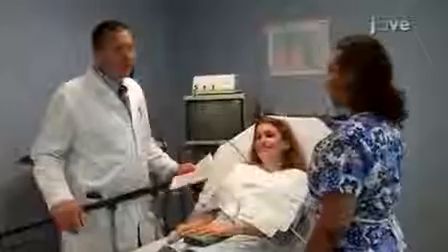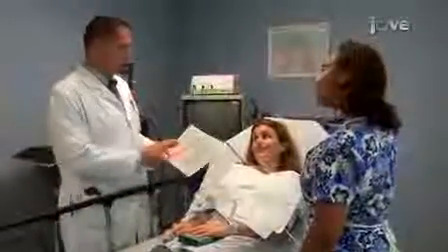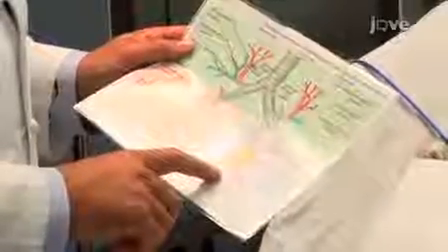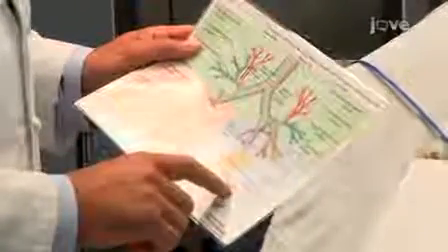The bronchoscopist reviews the lung map and plans the order in which the airway segments are to be assessed and treated. Treatment planning is crucial to the thoroughness and ultimately to the success of bronchial thermoplasty, helping to avoid under- or over-treatment of the airways.